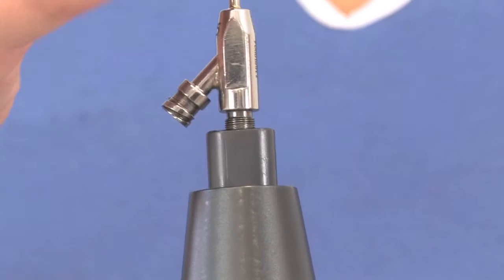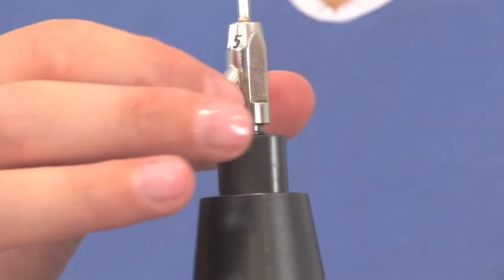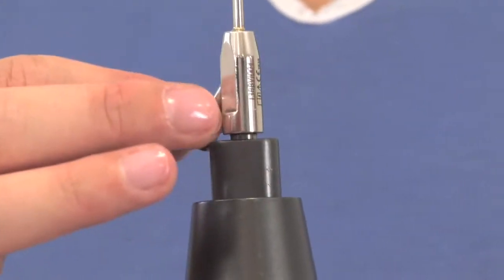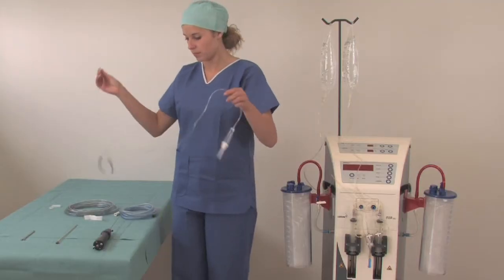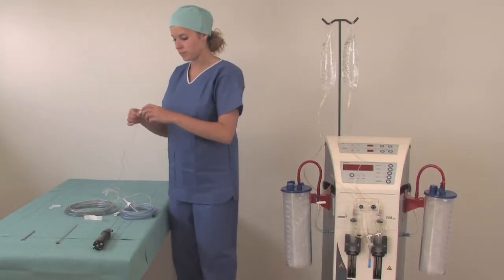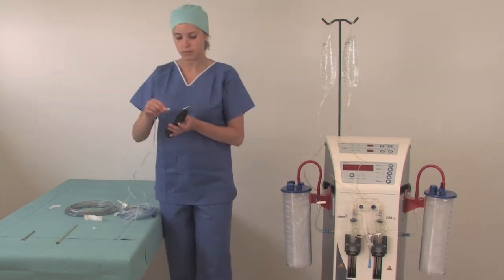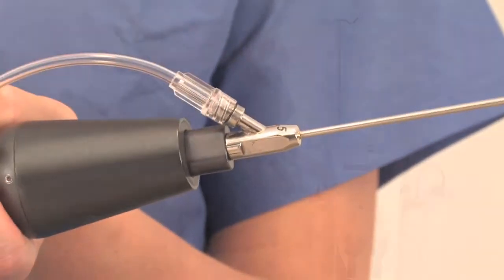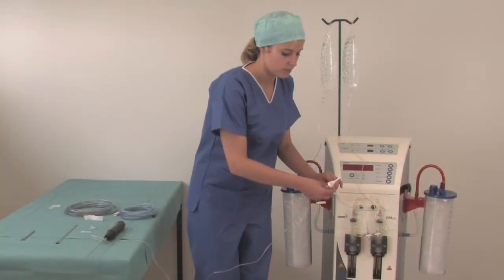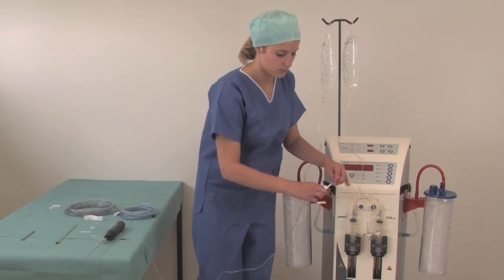Screw an infiltration cannula on the Lipomatic. Be careful not to cross-thread or force the cannula. Connect the luer connector of the perfusion line to the cannula. Connect the other end to the infiltration tubing.